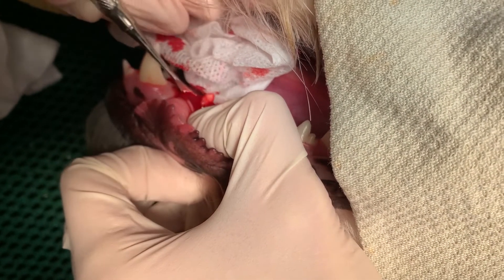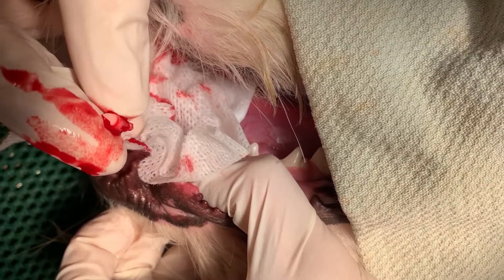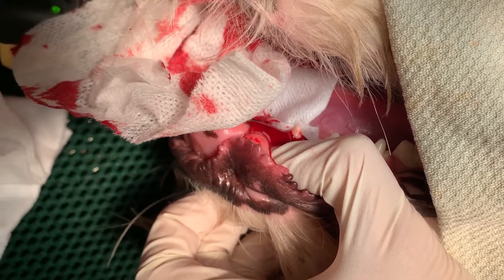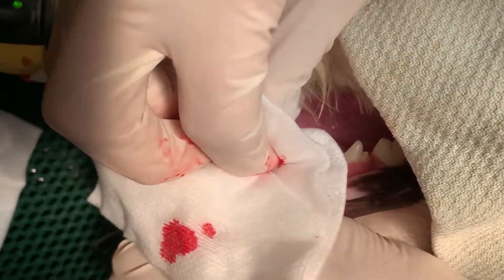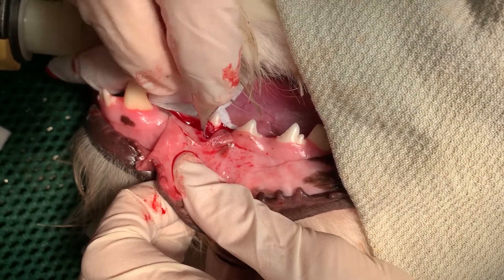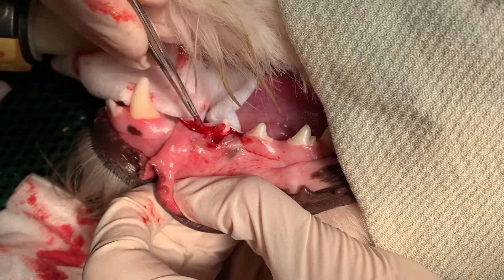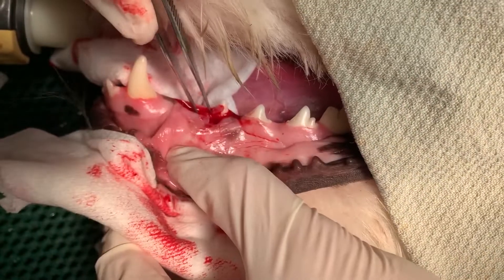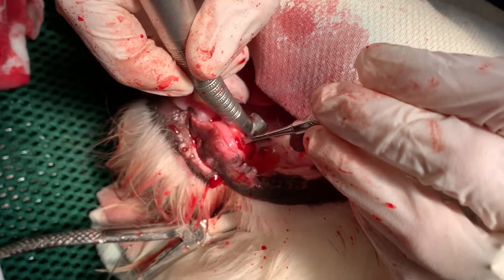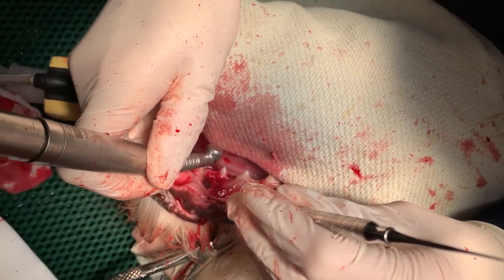It's amazing that one small little tooth can cause that big of a problem. That's why it is so important to make sure we're counting teeth and knowing what's there. You can see the bottom of that tooth is a little damaged from the dentigerous cyst formation. We'll go ahead and clean this pocket out now, because if we don't, we will still have a problem with the lesion. There's a cystic lining here that we're going to pull out and clean and debride. Once that's empty, we'll pull the gingiva back over the lesion. Now I'm taking a drill — a diamond head burr — to smooth and clean this pocket out and debride any of this tissue.